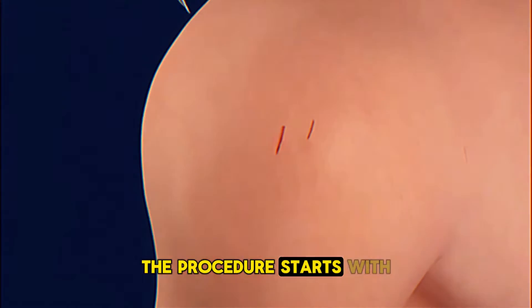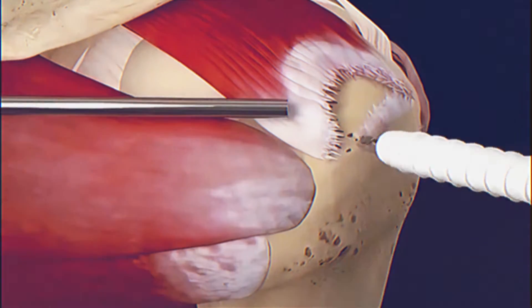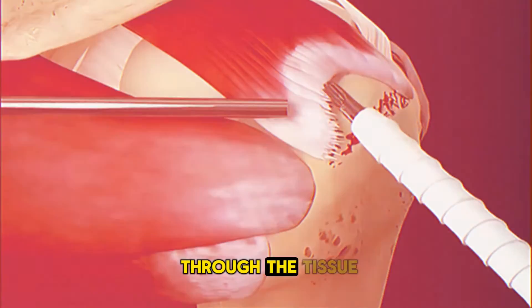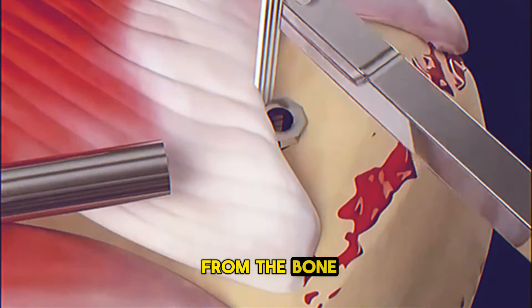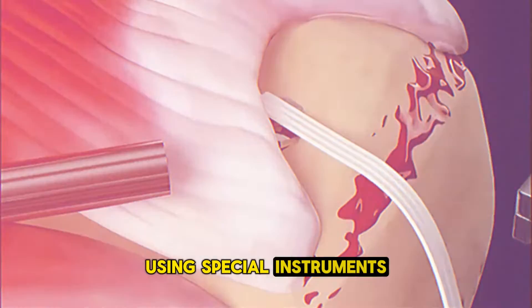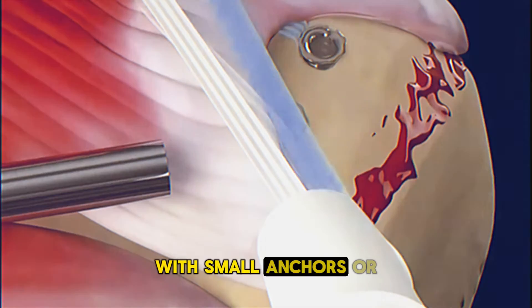The procedure starts with the surgeon making a small incision around your shoulder area. They then carefully move through the tissue to access the damaged tendon, which is often torn from the bone. Using special instruments, the surgeon reattaches the tendon to the bone with small anchors or stitches.